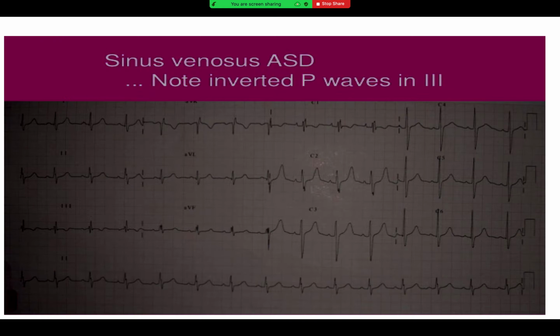How about this ECG? This is a real-life scenario ECG, for which I already gave you an example. What I had said is, look for the crochetage sign in the inferior leads. Over here you see it in 2, 3, aVF already. Lead V1 also has an R-dash pattern, and so this is a typical sign which should make you alert, especially for the sinus venosus.